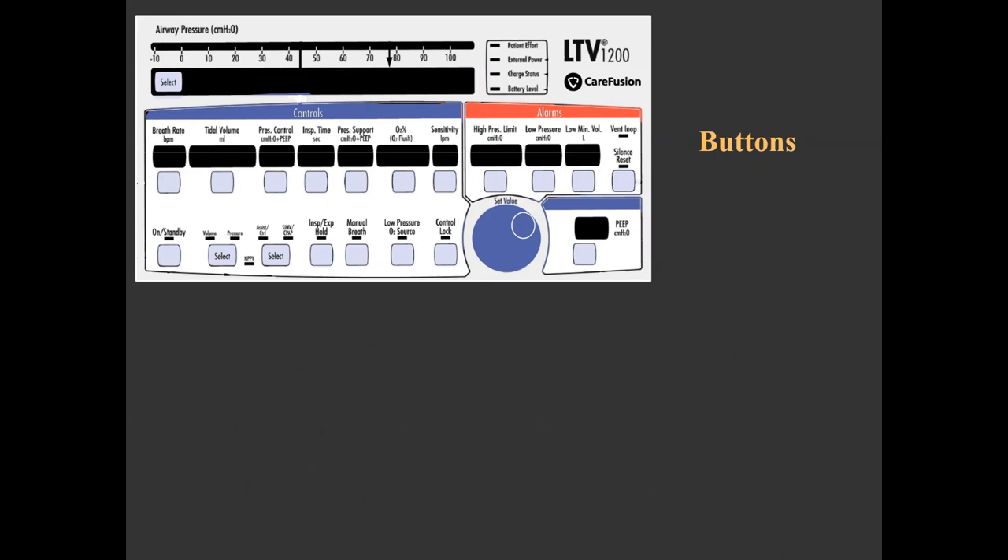Three types of buttons exist: control buttons that allow setting indices for the ventilator and alarm boundaries; mode buttons that allow toggling between breath types and ventilator mode; and function buttons that perform a specific function when pushed.